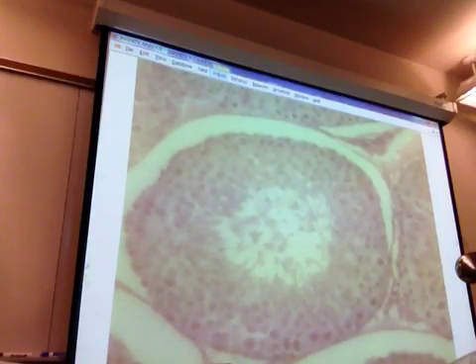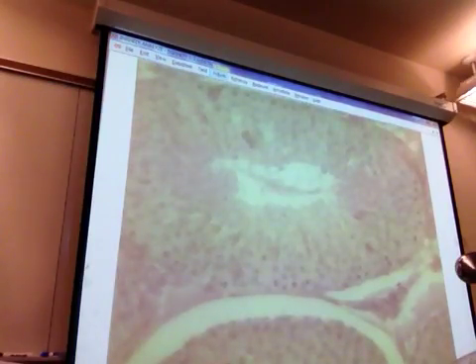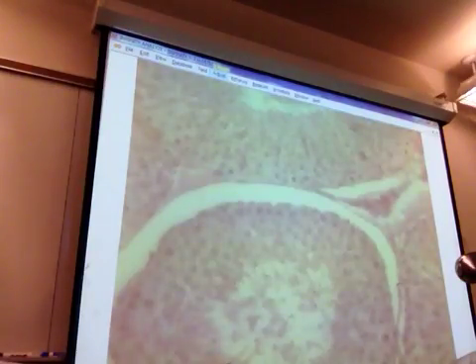Do you have to know the luminal layer from the basal layer? I wouldn't know the luminal layer versus the basal layer, because that would be really hard for me to point out. But your teacher might have different thoughts. Unless I had a really perfect cut, I would feel kind of weird pointing that out on a practical.